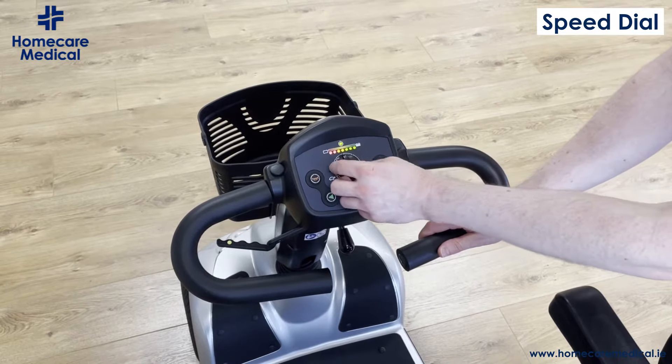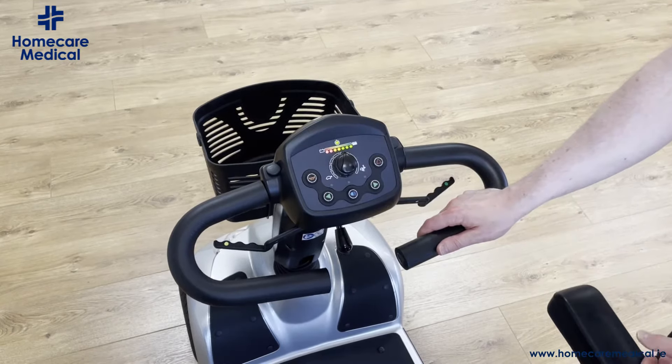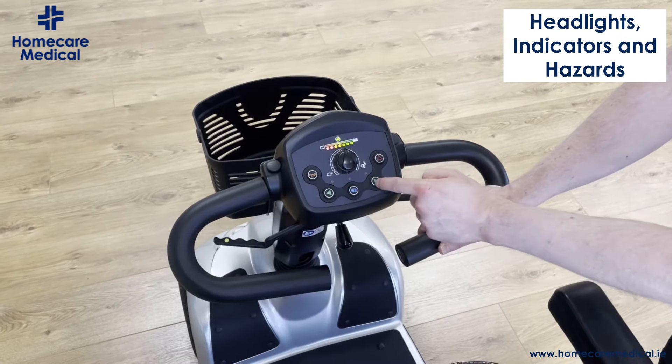Your speed is controlled by the dial. Turning towards the left will slow the scooter down; turning towards the right will bring it up to its maximum speed of up to eight kilometers an hour.